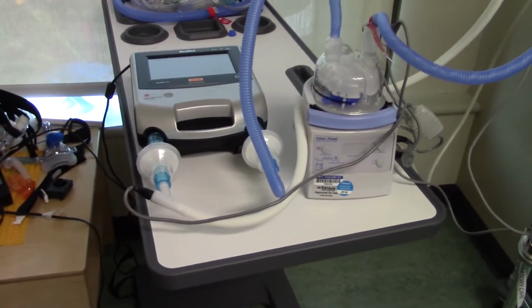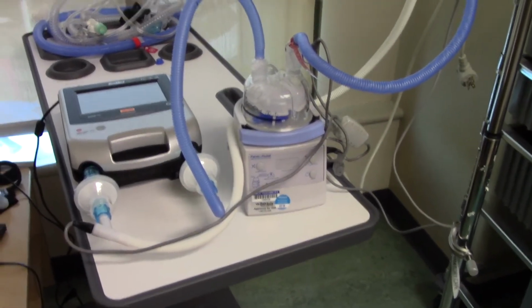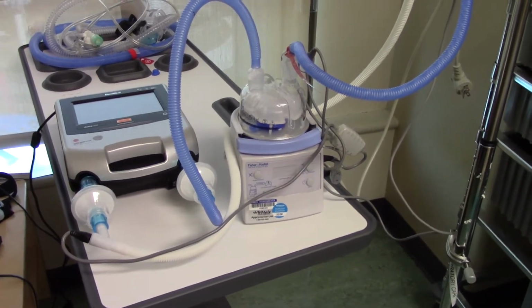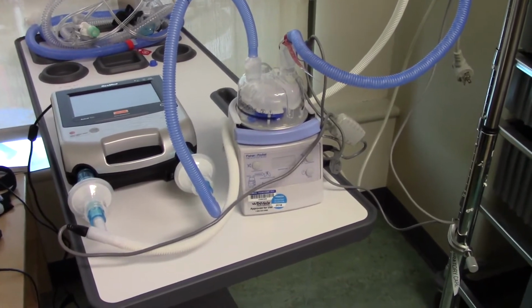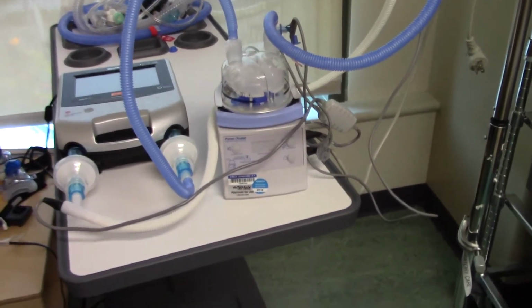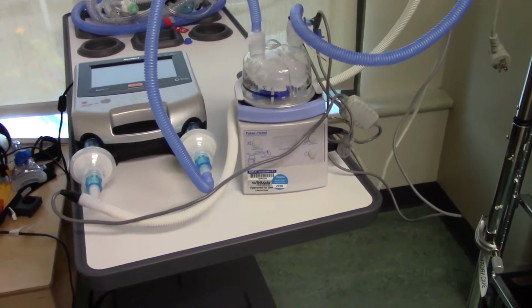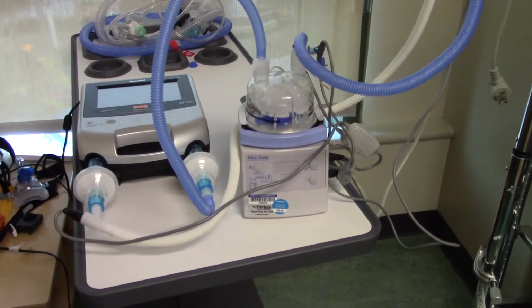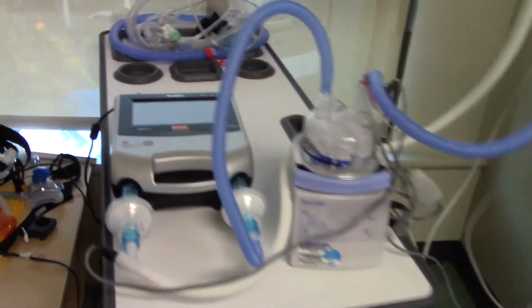So first we're going to use the dual limb circuit just like we use on the servo. You all know most Astrals are set up with single limb circuits for home use, but we're going to use the dual limb circuit to try to recreate everything the way of the servo. We're going to use the same size circuits we do on the servo: 15 kilos and less is infant, greater than 15 is an adult. We're going to use our circuits with our heated wires and our heaters, just like you see here in front of you. And our process of NEB delivery and MDI delivery is going to be the same placement and delivery practice with this as it is with the servo.